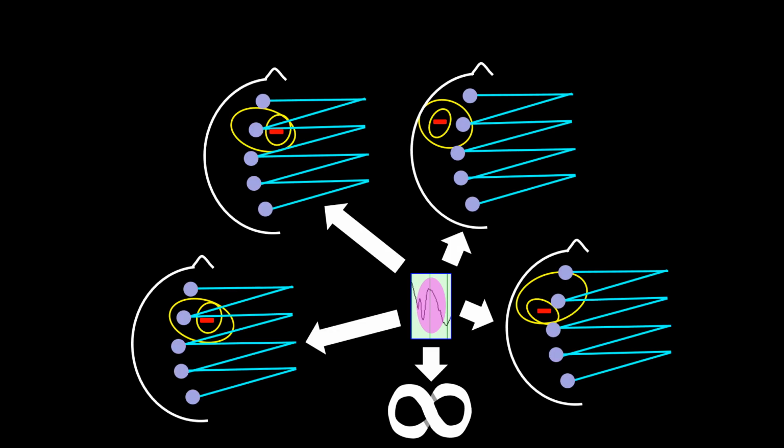An electrical event can be produced by an infinite number of voltage sources, configuration, or generators within the head. This issue is called the inverse problem.